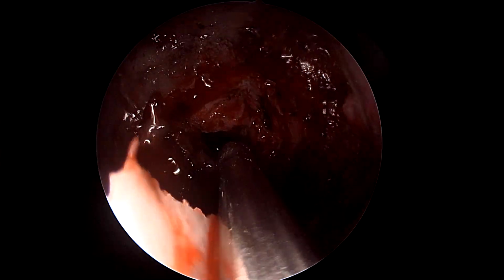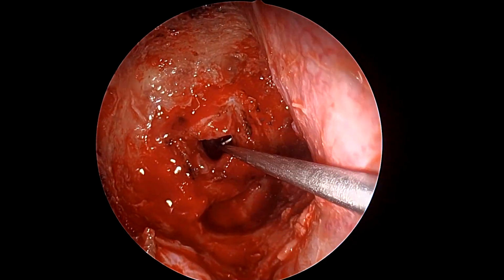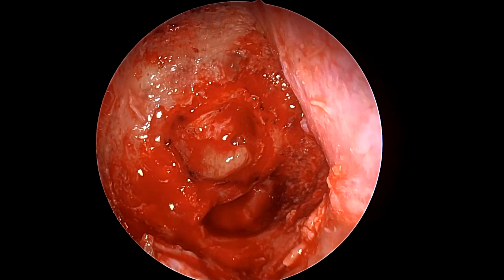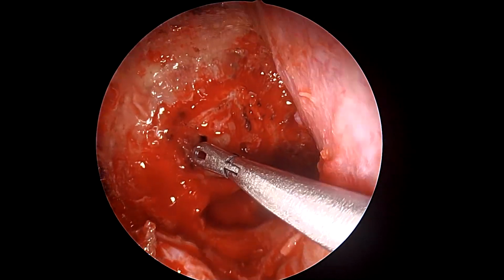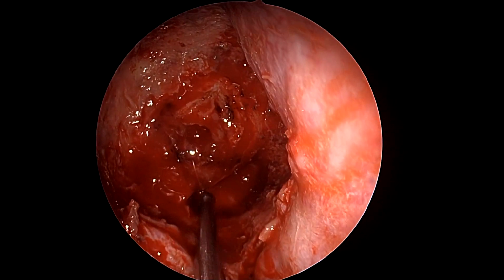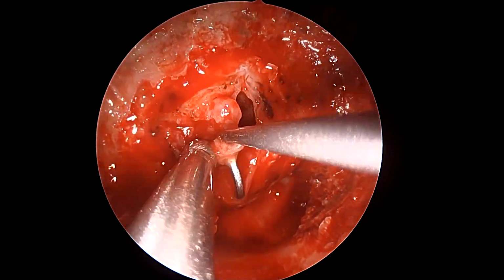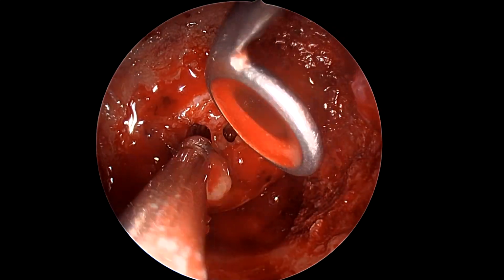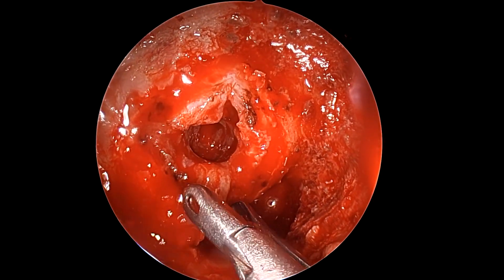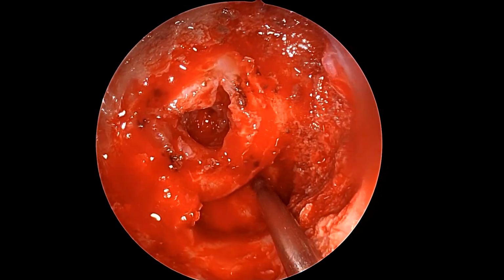So, again, one has to be very, very measured about the suction we use. The suction could be the best friend as well as the biggest enemy. The suction we are using here is skull base suction, which is tapered all the way from the base to the point of contact. It is olive tipped and it has a large, variable thumb control. It basically makes it a very, very controlled and weak suction, but we reserve it for all critical neurovascular issues such as the sella or the lateral skull base surgery where we are playing around cranial nerves and dura, so that it does not end up sucking aggressively any structure which we don't want to. It's a very mild suction.